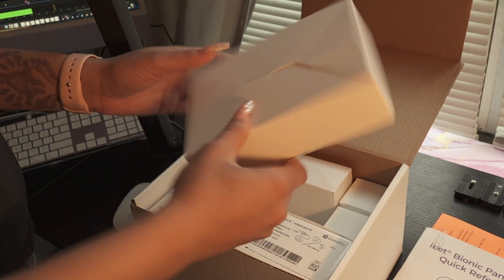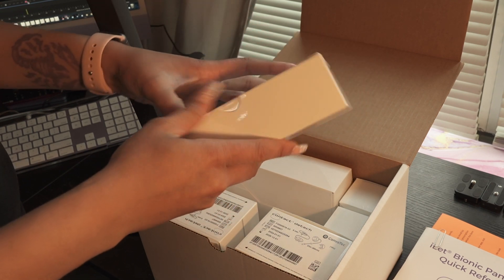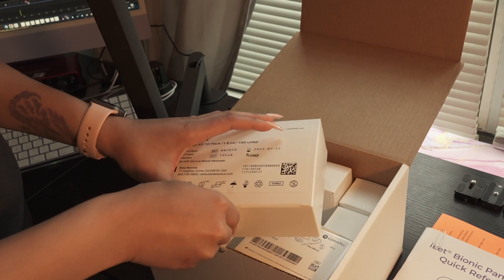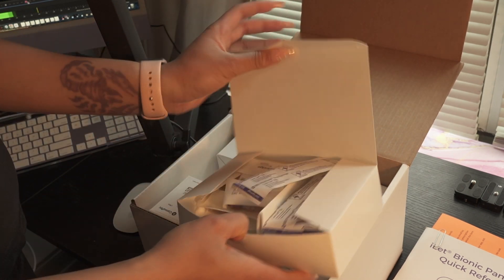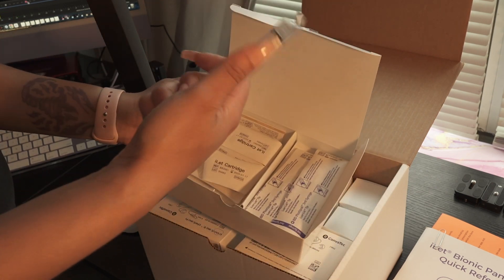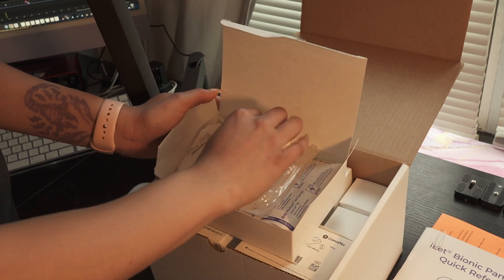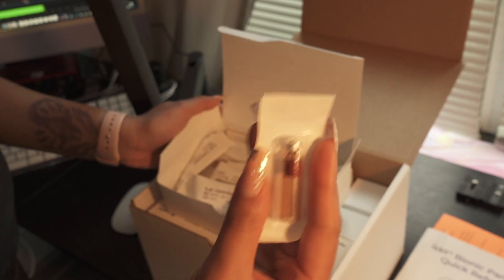We have the cartridge — this is the cartridge that goes inside the iLet. And these are the syringes.